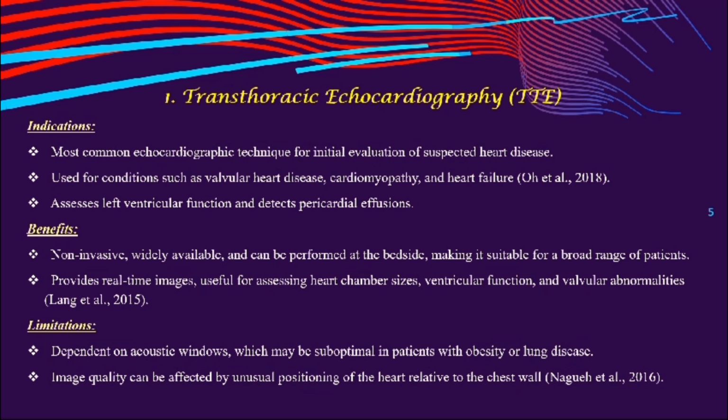Benefits. It's non-invasive, widely available, can be performed at the bedside, making it suitable for a broad range of patients. Provides real-time images useful for assessing the heart chamber sizes, ventricular function, and valvular abnormalities. The limitations. It depends on the acoustic windows, which may be suboptimal in patients with obesity or lung disease. Image quality can be affected by unusual positioning of the heart relative to the chest wall.